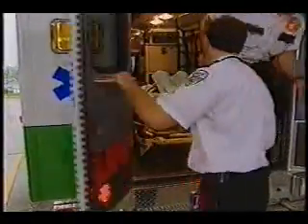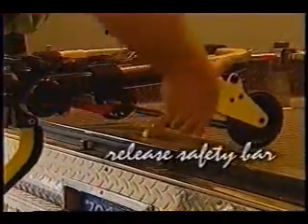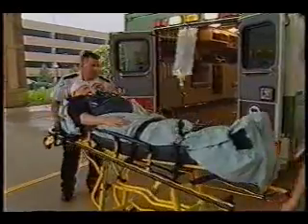To unload the cot with a patient, disengage the cot from the fastener. Just be sure to keep it elevated long enough for the legs to fully extend and lock. The optional safety hook engages to help keep the cot from moving out of the ambulance. Release the safety bar and roll the cot away.